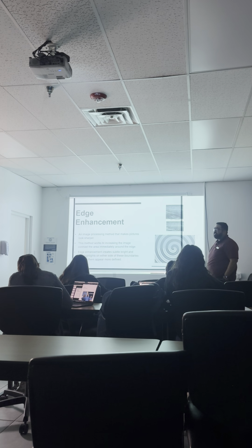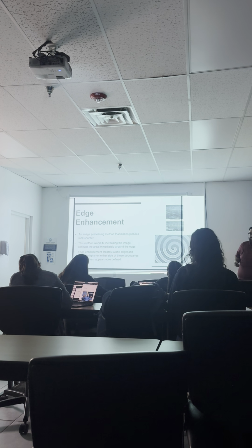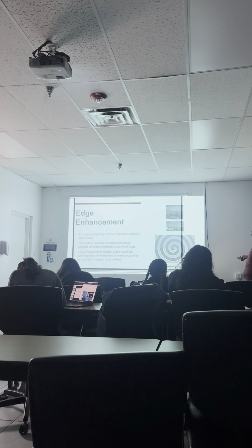Okay, edge enhancement. What do we say that edge enhancement was? It helps define the borders between different tissues, right? Okay, so as we can see here, this is without edge enhancement. Can we tell the difference in the borders? Not really. Kind of, but yeah, you can. You can, right? Yeah. But what happened here? You could tell them apart really well.